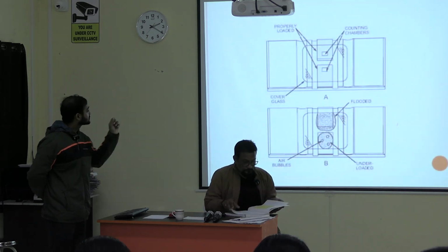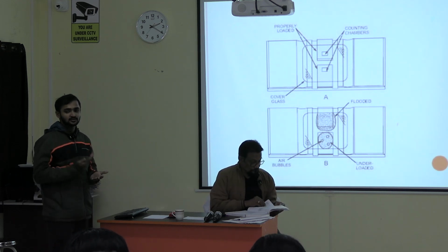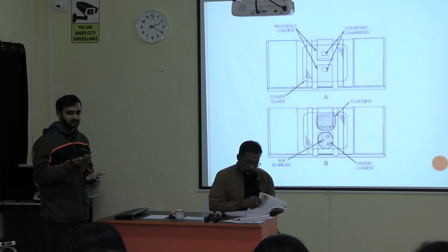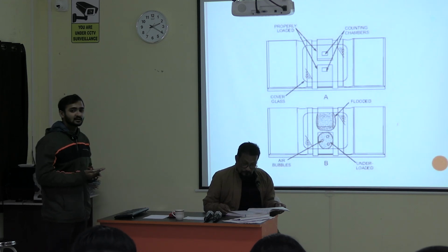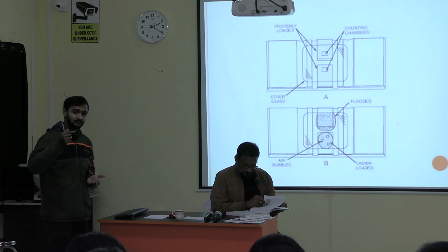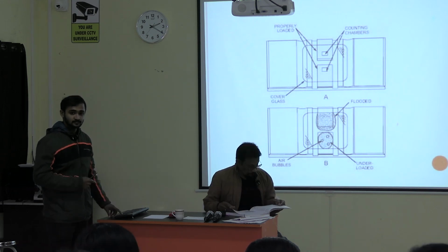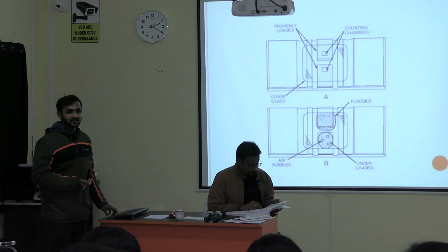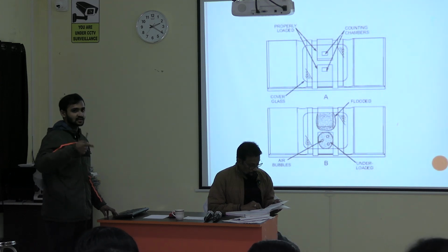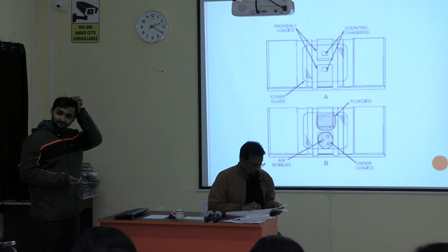So where will you put the drop? Before that, you need to ensure the Neubauer chamber and the cover slips are dry and clean. After that, you need to focus the chamber under the microscope in 10x. Only after that will you charge the chamber. How will you charge? At the edge of the cover slip, at an angle. What will happen then? The first 2 drops are discarded.